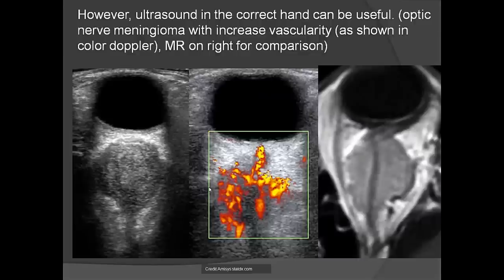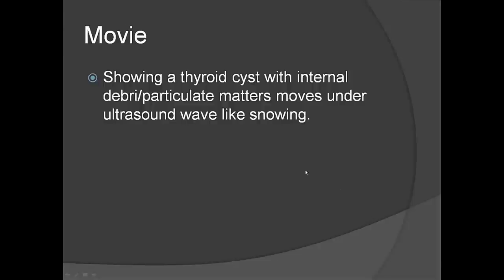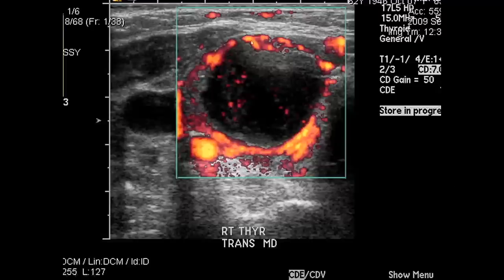Ultrasound is not used as much nowadays in the United States, but in the right hands it can be very useful. You can see the eyeball and a lesion beyond it; with color Doppler you can see blood flow. This correlates with MRI — here showing a meningioma surrounding the optic nerve. I'll show you a thyroid cyst with debris floating inside, moved by the ultrasound wave. Importantly, ultrasound does deposit some energy into whatever it images and can move small particles inside the eyeball.